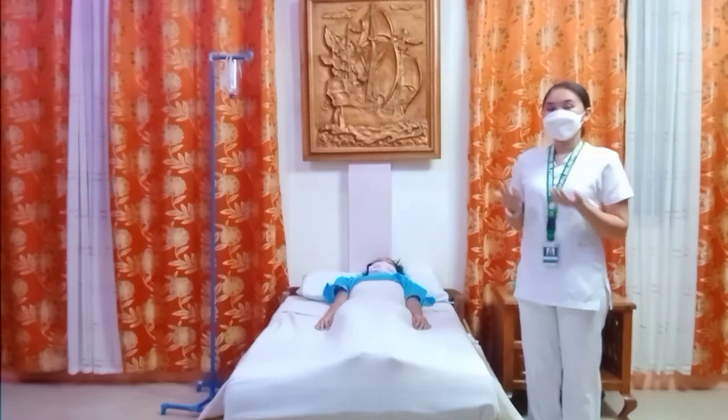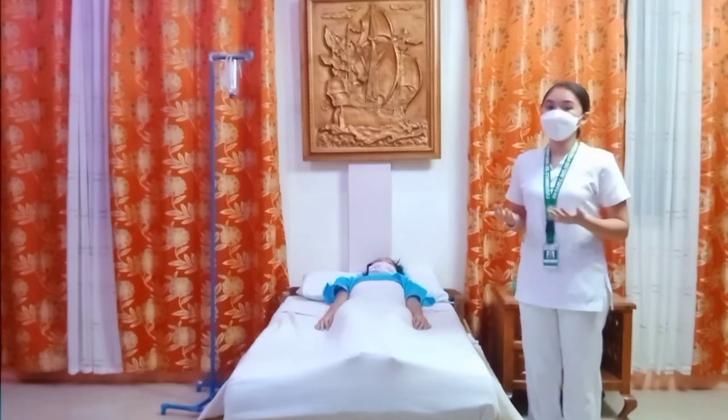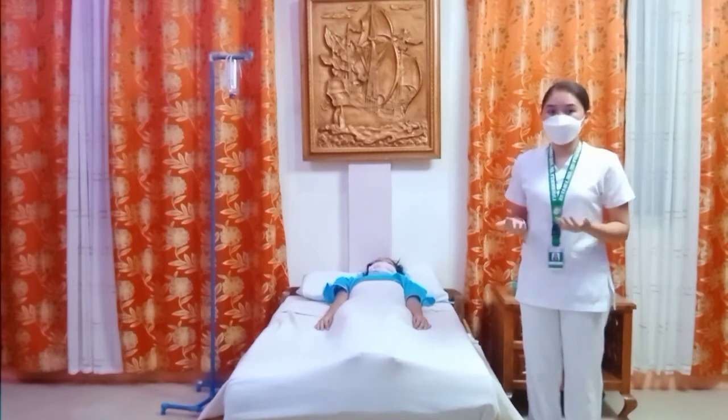The purpose and significance of taking the blood pressure is: 1. To obtain a baseline measure of arterial blood pressure for subsequent evaluation, and 2. To determine the client's hemodynamic status. First is to introduce yourself to the client and verify the client's identity.